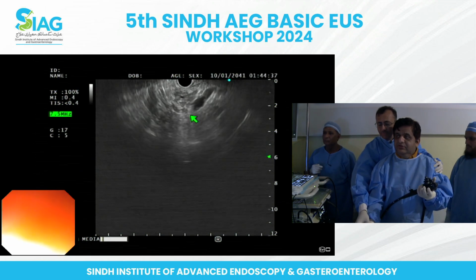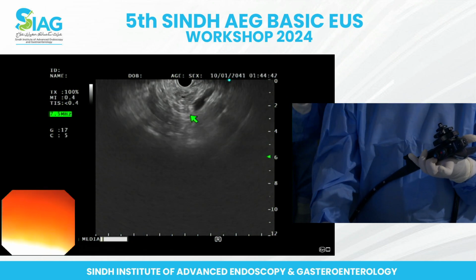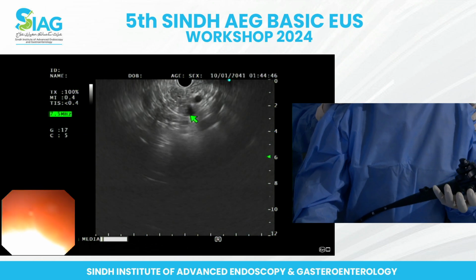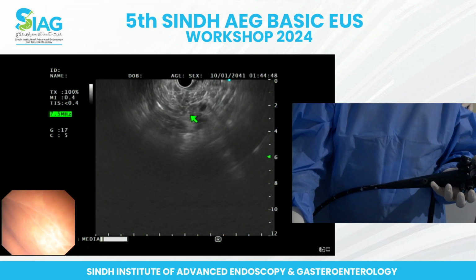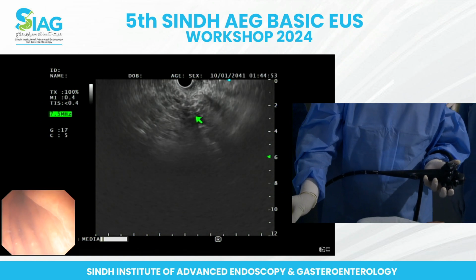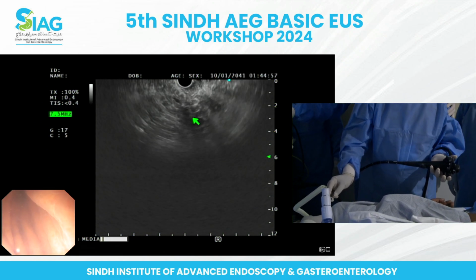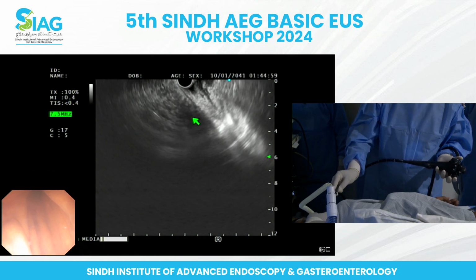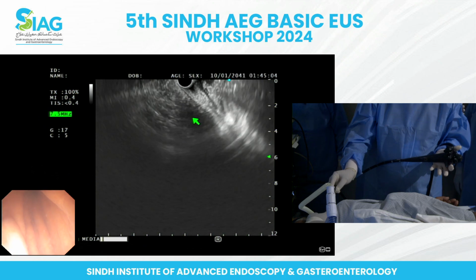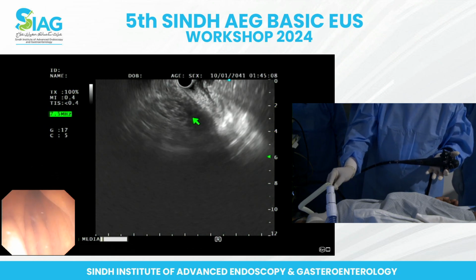Okay, sir. Avoid this thing. Okay, sir. Right. Now clockwise, counterclockwise, keep tip up, tip up, tip up, and slight pull back. And there you see the pancreatic duct coming down. This is the pancreas. This is coming down towards the head of the pancreas. So you need to keep it clear. You need to, again, I think you are injecting air. You're not supposed to inject the air. Every time you're going to inject the air, you're going to lose the image over there, right?